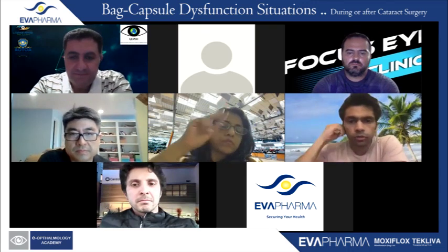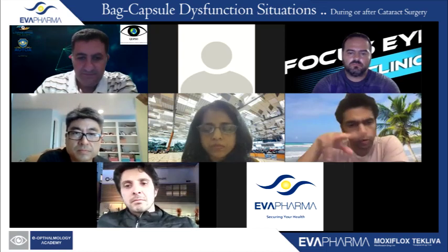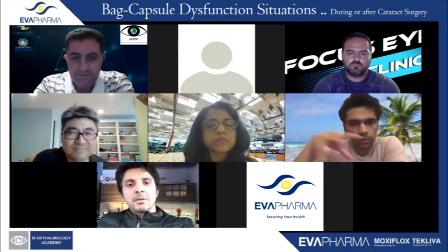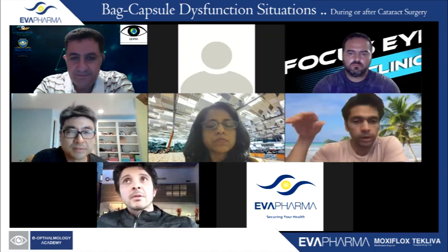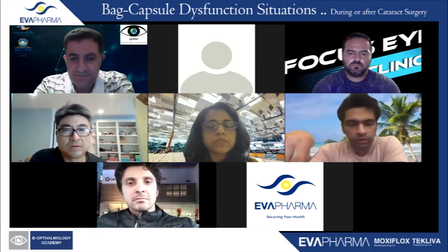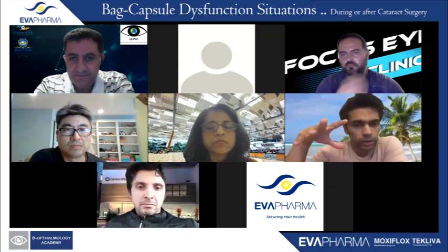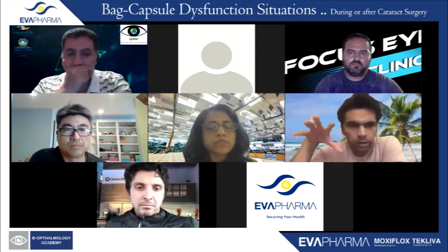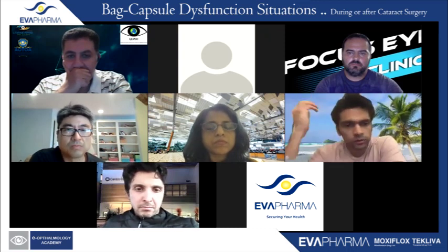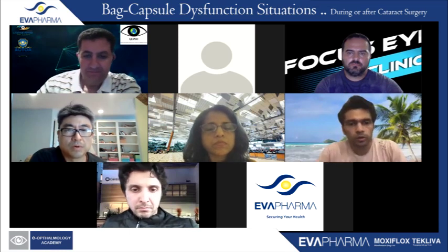Brian, there are two questions that come up. One is, how do you keep the angle right on both the sides? I know that in Yamani, the angle is such an important step to get the tilt completely off. And the second question, which has come up in the Q&A box, is about the 27 gauge needle, because I think the 30 gauge needle has also seen a depletion in parts of the world. So can we use a 27 gauge needle? Why not? We'll just make the flange a little bigger. These are the questions that come up. So any comments on that?